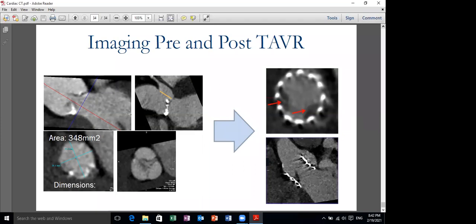برضو لو عملت كالسيوم سكور ولقيت في very dense calcification في الديستال ليفت مين او proximal LAD، حتى لو الكالسيوم سكور 400 بس هم amalgamated في critical area، انا بكنسل ذا تيست حتى لو اقل من الثريشولد ده، لان في النهاية هقول له ان في جزء critical جدا I couldn't interpret، فساعتها you are justified to cancel the test.